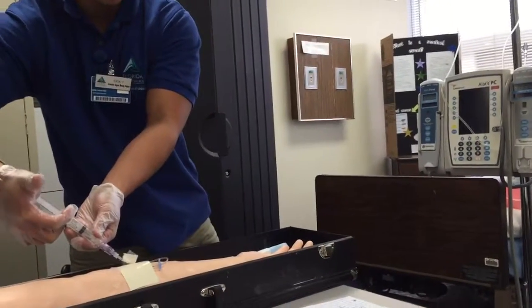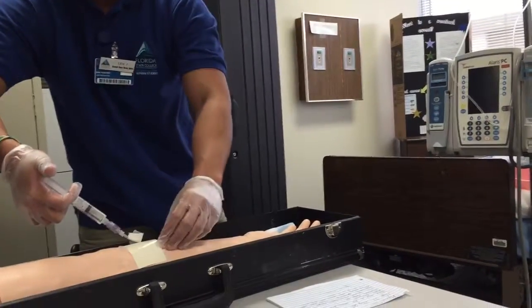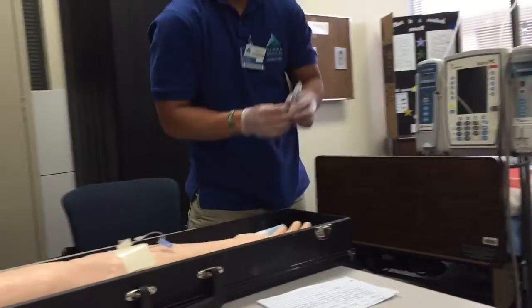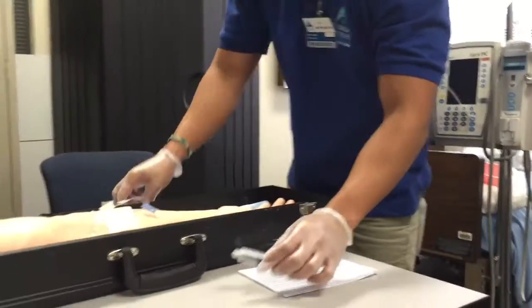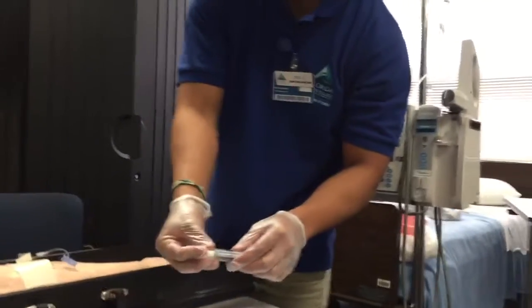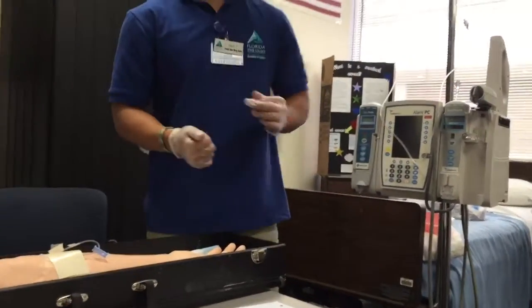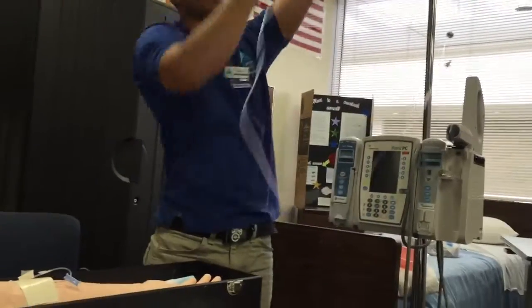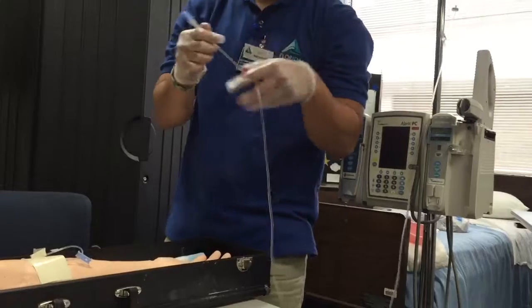and push, stop. Applying positive pressure, I'm going to re-clamp this. So that's good right there. I'm going to go ahead and take this off. So that's ASASH. And then this would still have a cap on it technically, or a new one. And then I would now go ahead and connect the mini bag to it, which I would take this off.